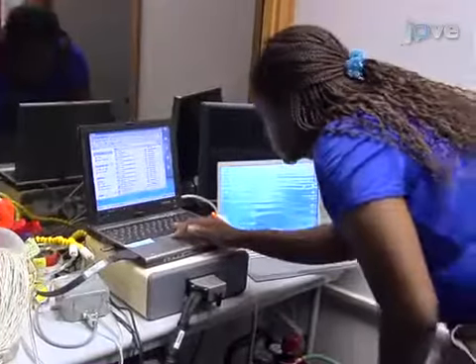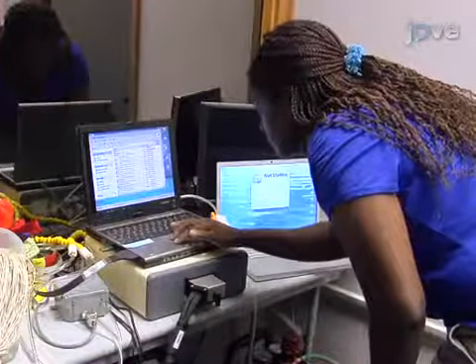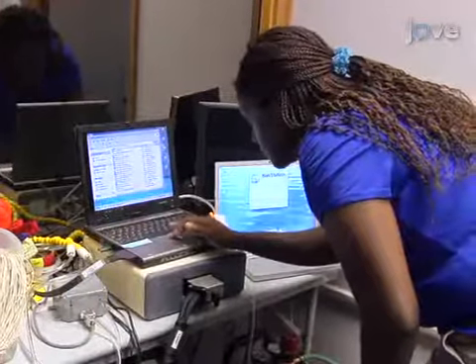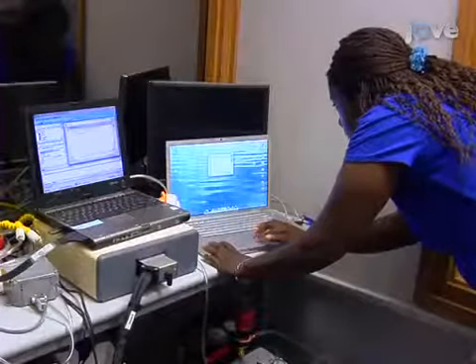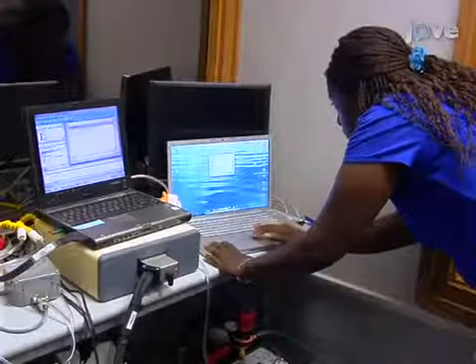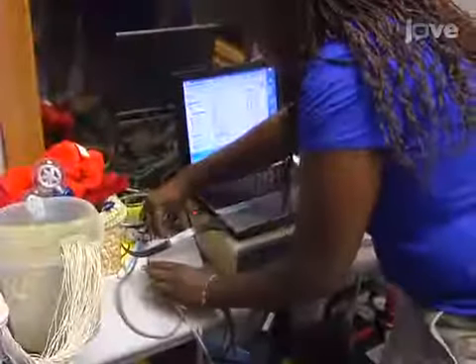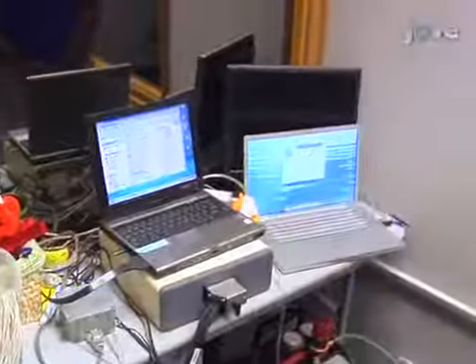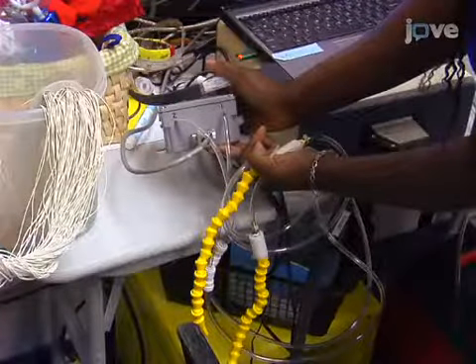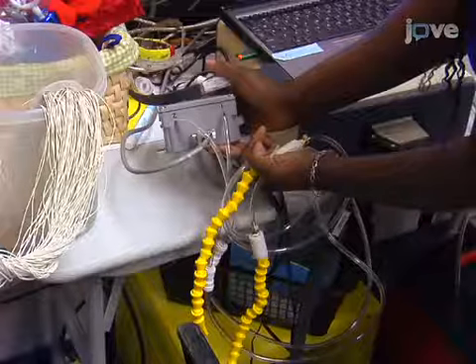To program the stimulus control application for this protocol, first set up two serial commands. One command should identify the puff, the other the sham. Have the stimulus control application send the commands to a microcontroller. Have the microcontroller generate a 20 millisecond duration TTL pulse to the corresponding digital output channel.